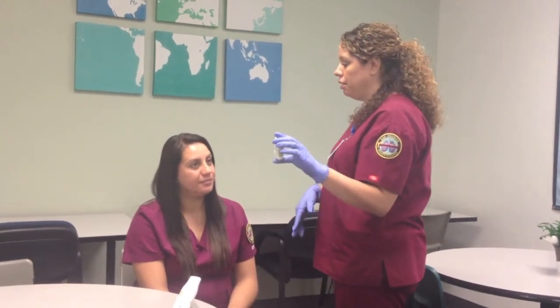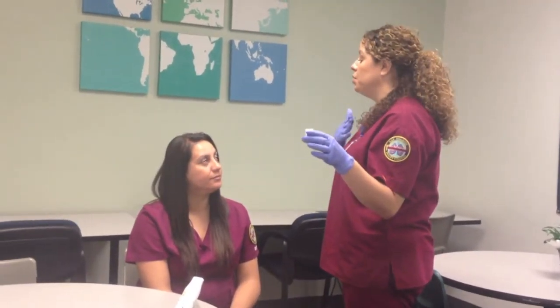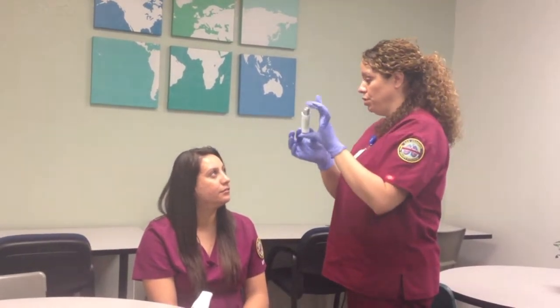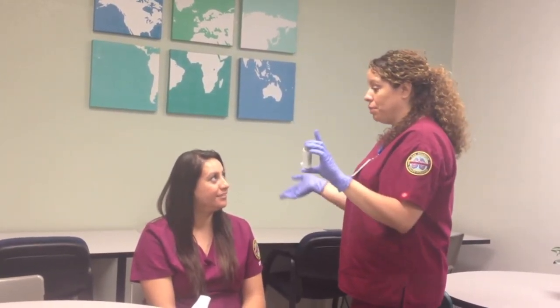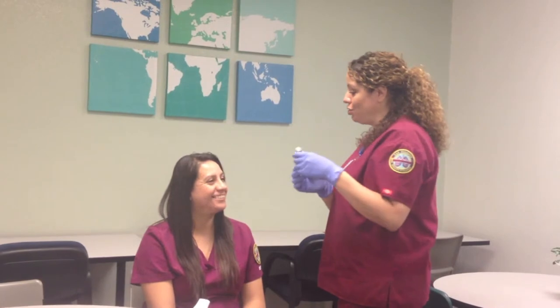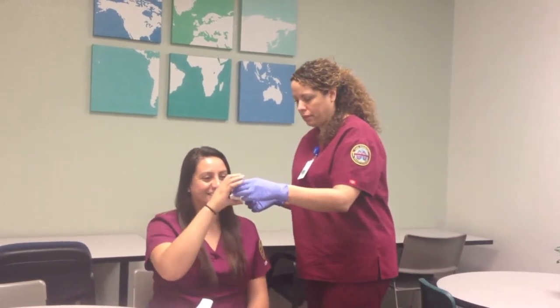When you're using the inhaler, you want to start by raising your head up like you're smelling something really good. Then you're going to place two fingers in front of your mouth. As you start to breathe in, that's when you want to push right here, then continue your breath and hold it for three to five seconds. Some people like to place their mouth on the mouthpiece, but we've found you get a better dosage with the two-finger method. So let's go ahead and try it.